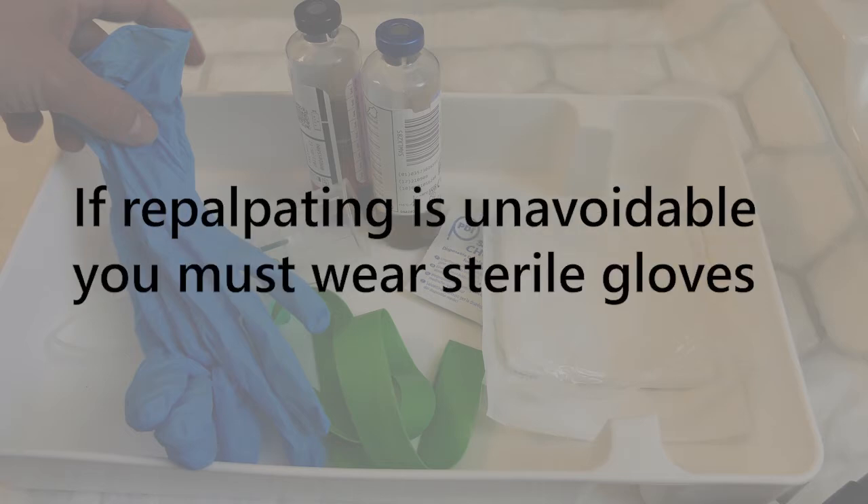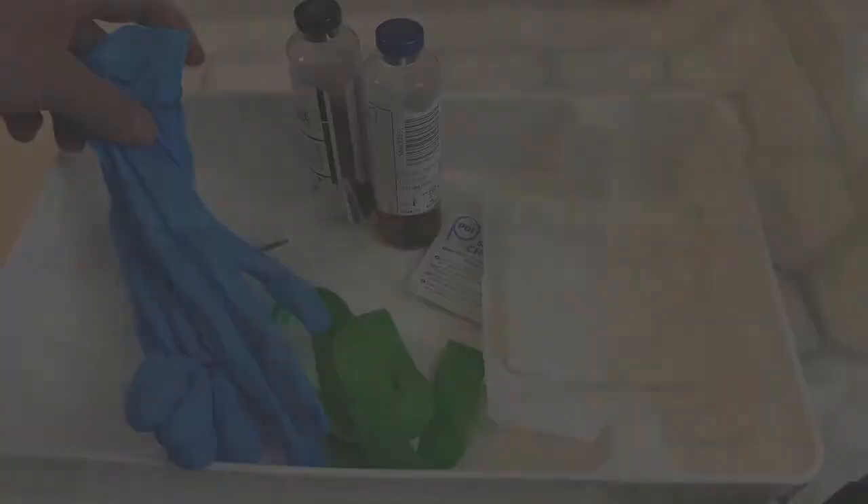However, if on assessment of the patient's veins they are very difficult to find and there is no obvious landmark to help locate the vein after skin cleaning, then a pair of sterile gloves must be worn if repalpation is unavoidable.